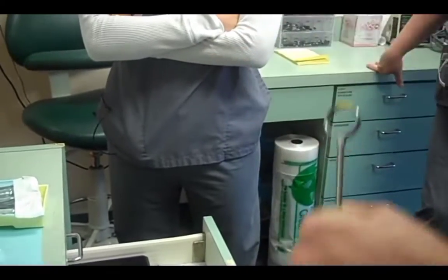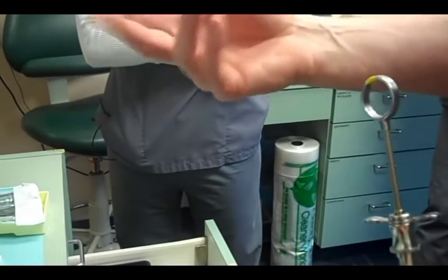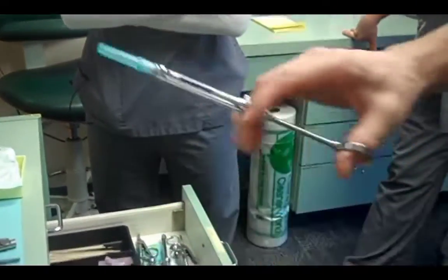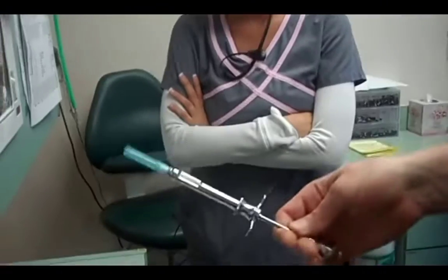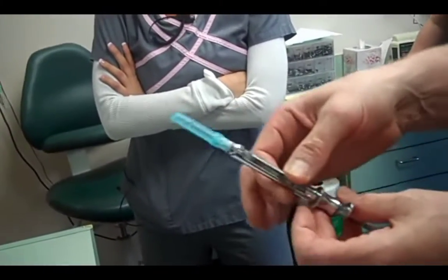Now, if you've loaded, make sure that the hub is set. Don't do that. Go ahead and set it, because the worst thing that possibly can happen is we do an injection and pull back and it's loose, then I have to make a decision either to inject possibly in a blood vessel or to pull out and give them another shot. So you'll find that this is the most common setup. If we're treating a lower molar that's had endodontics, we'll just infiltrate.